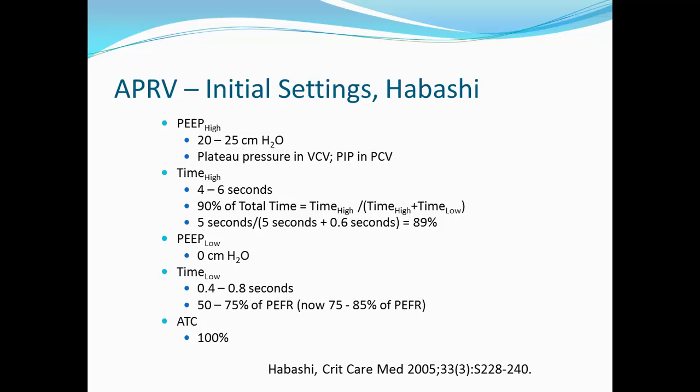Now on the next slide I'll show this a little bit more. Dr. Habashi also recommends using ATC at 100% of the properly set ET tube.